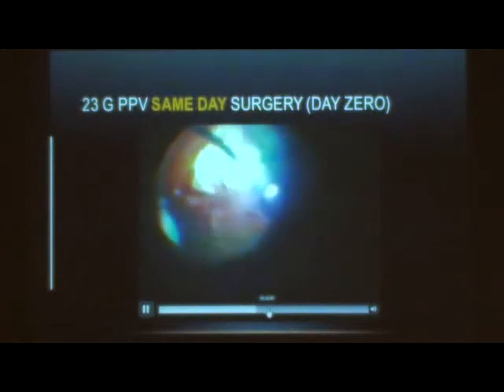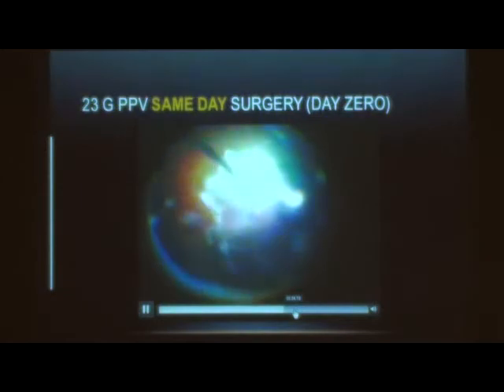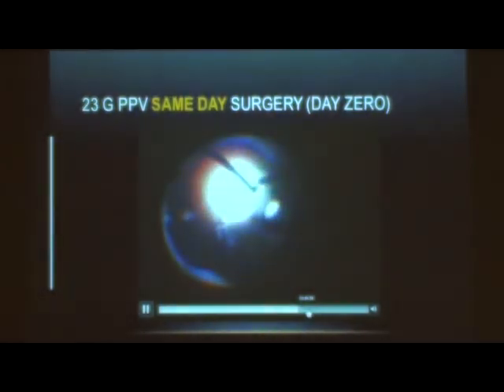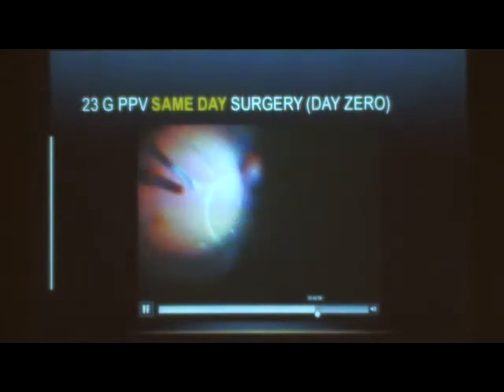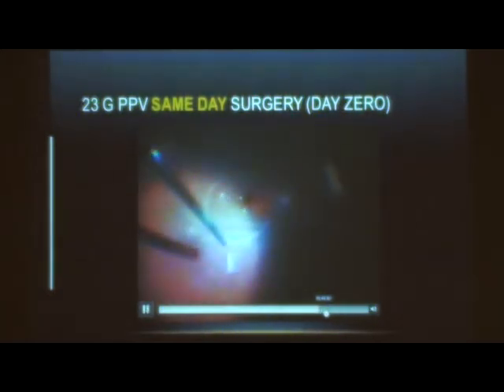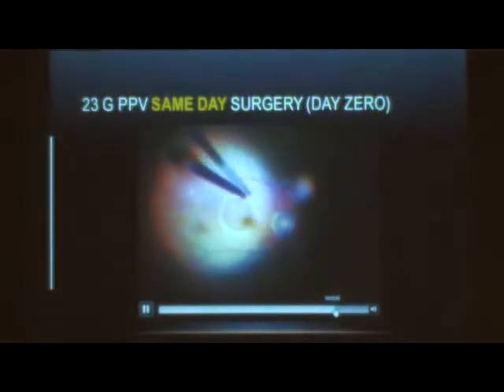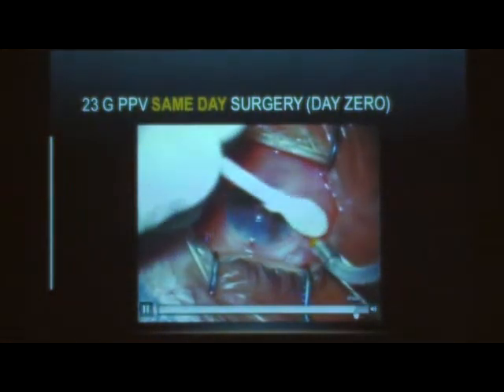You do a proper vitrectomy, a 3-port vitrectomy. Again, you can completely crush the nuclear fragments. Sometimes I put a drop of perfluorocarbon on the macula just to protect the macula, but it's really not necessary. But if you are more meticulous, you can do that. And then you can remove it at the end of the surgery once you are done, with a patient that is potentially 20/20 vision. Again, you remove your cannulas and you are done.